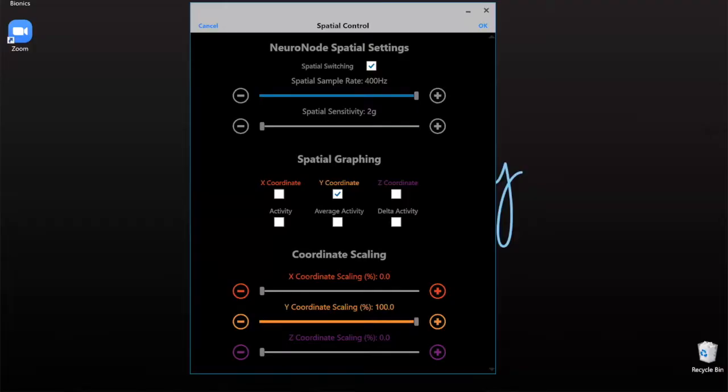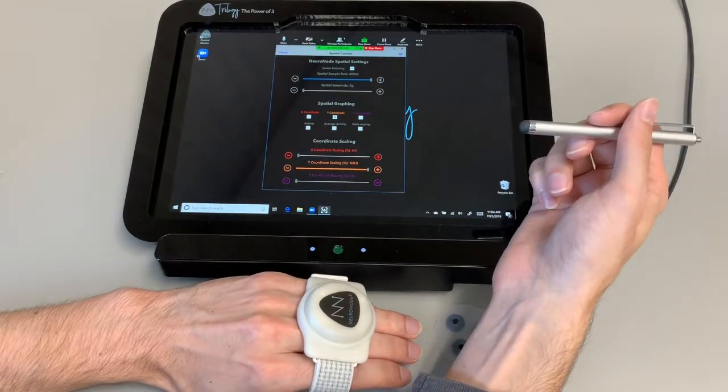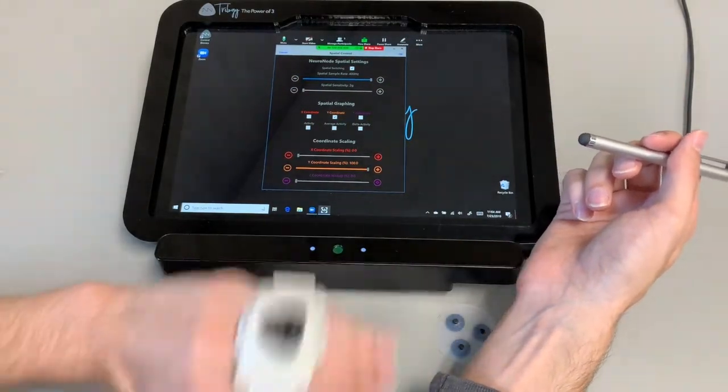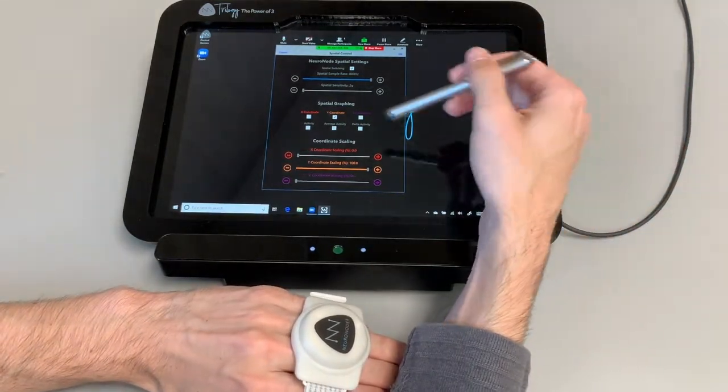Now the spatial sensitivity — the 2G that it has right now means it's going to require very little motion to get it to read that movement. If we turn it up, it's basically going to require even more movement in order for it to read what's going on. So instead of this small shake, I would probably have to give it a pretty big shake. So we're going to keep that on 2G just for that small motion.